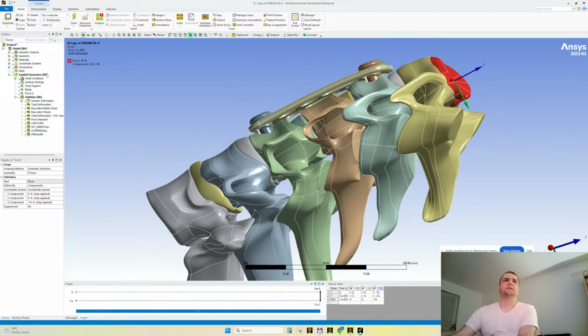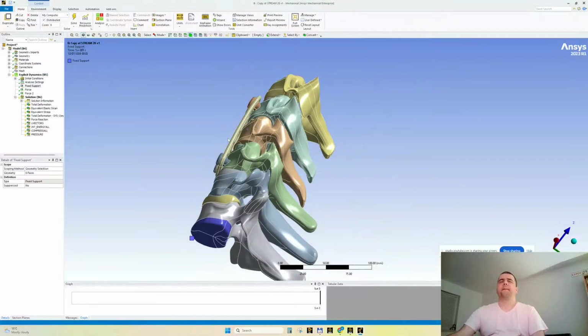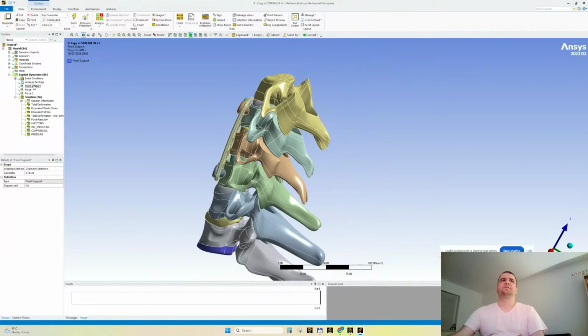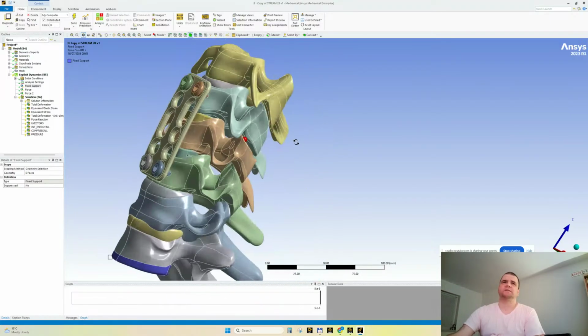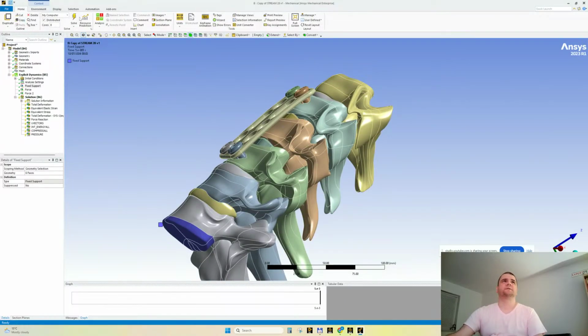Forces, is it applied correctly? Yes. Force, yes. Fixed support, yes. The load is not too high. So we will have values, but we will not have big displacement, yes? We'll have stresses and so on, but we will not have very spectacular displacements or whatever. Save. Yes, we should be fine, I think.